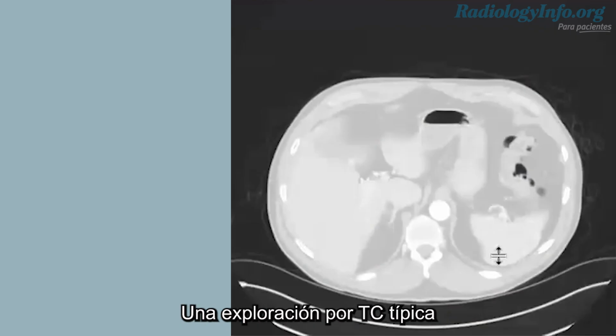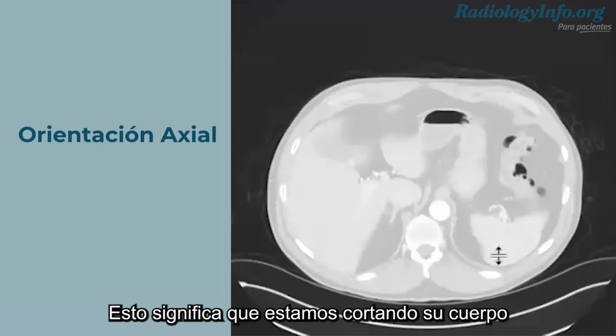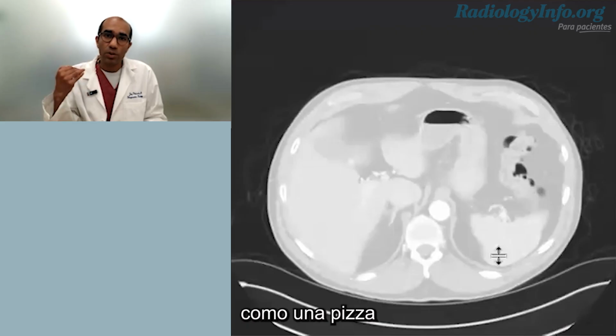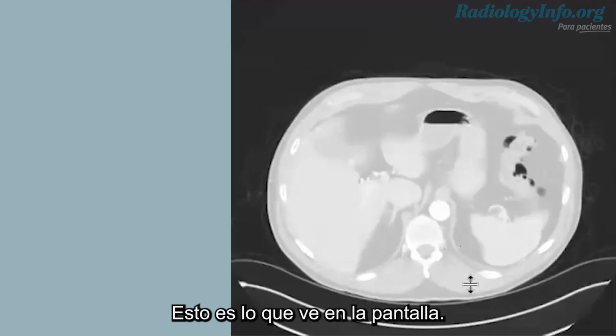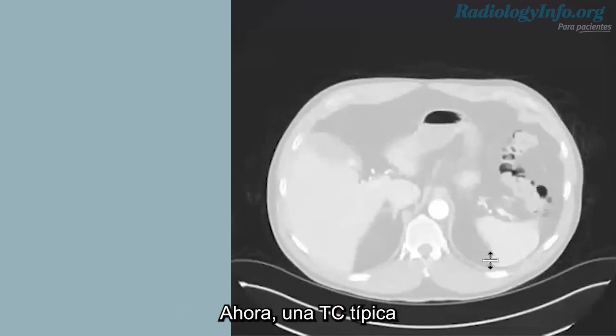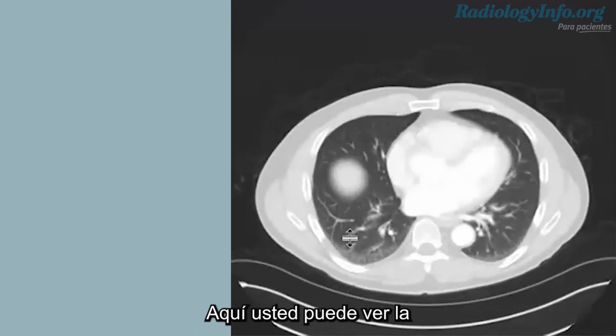A typical CT scan is acquired in an axial orientation. This means that we're cutting your body like this, sort of like a pizza going from head to toe. That's what you're seeing on this screen. Now, a typical CT abdomen and pelvis will also include portions of your lungs. Here you can see the bottom of your lungs on these images.